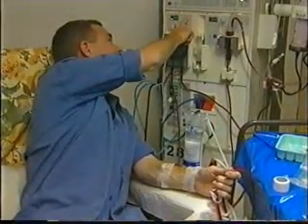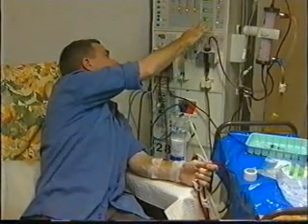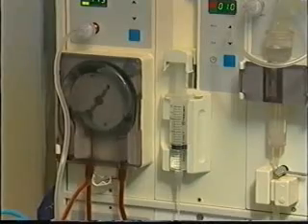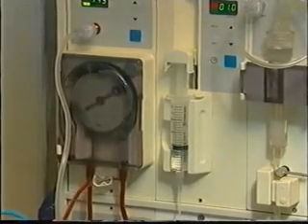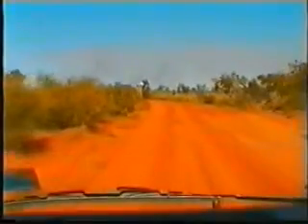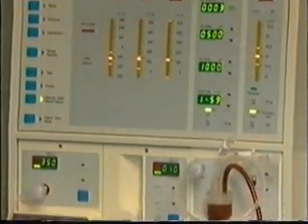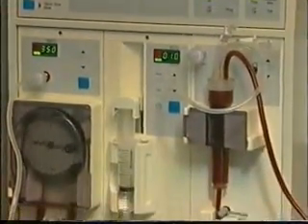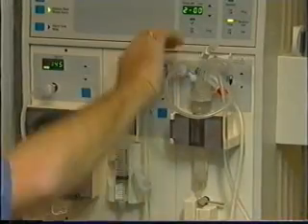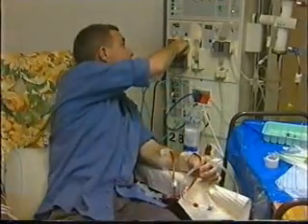So turn my pump speed up, it's like taking fluid off. Last year, people from Tennant Creek got together to try. When you see the kidney machine for the first time, they can look a bit scary, but you get used to them. With self-care, each person only learns about one machine, and this machine they use all the time.